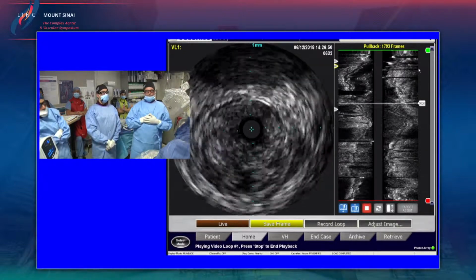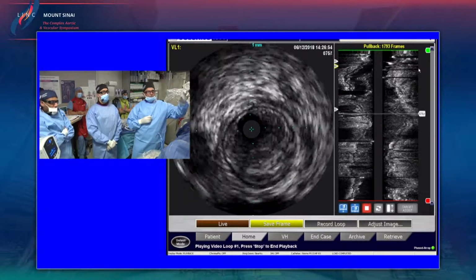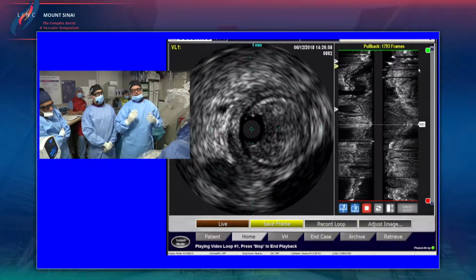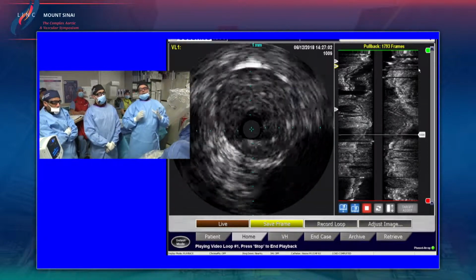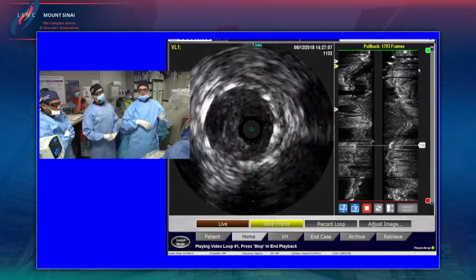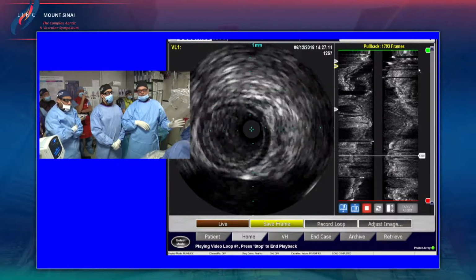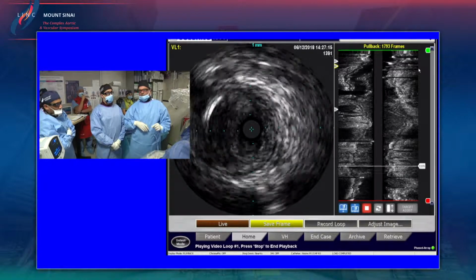And what we were worried about, as you can see by the IVUS, there is a thrombotic component along with an atherosclerotic component. So in this type of case, at least our algorithm here at Sinai, Giancarlo, is to go ahead and do some sort of aspiration therapy. In this case, we decided to do an AngioJet therapy with filter protection. We know our distal vessel is patent, so our plan is to do the AngioJet protection and then come back to you to see how it looks.